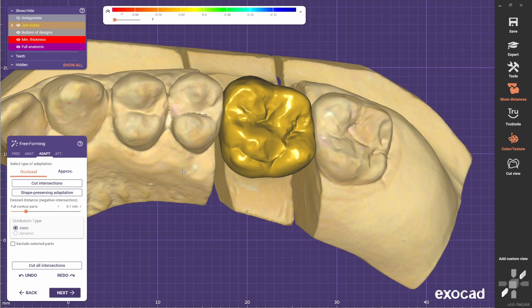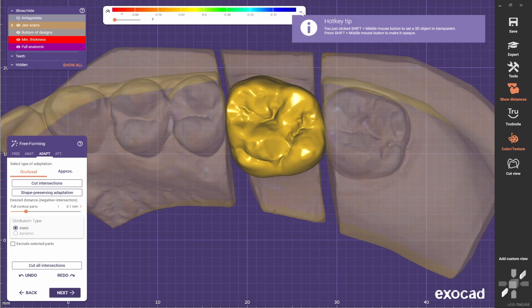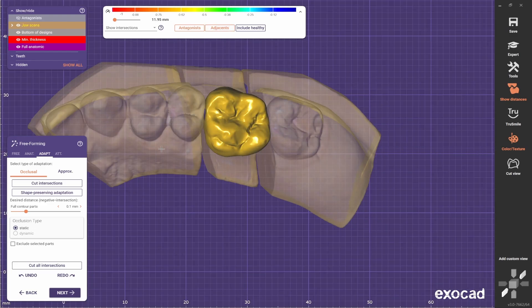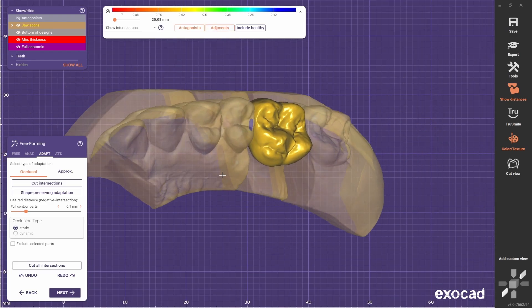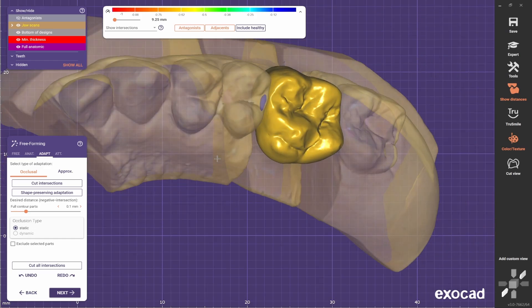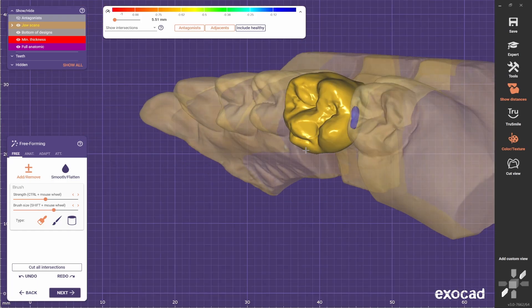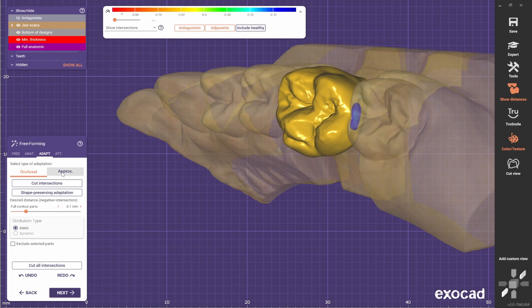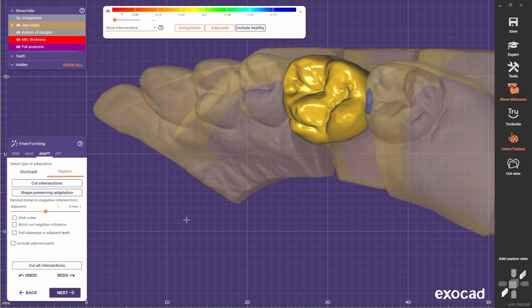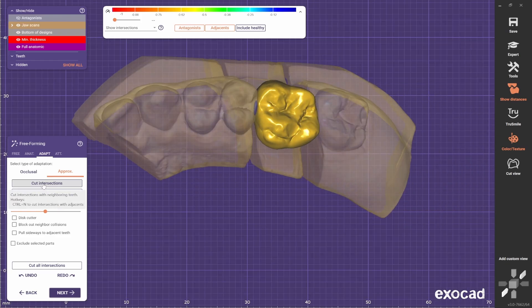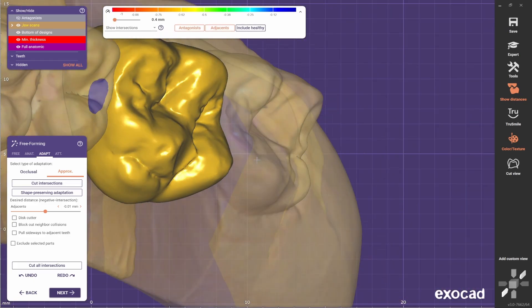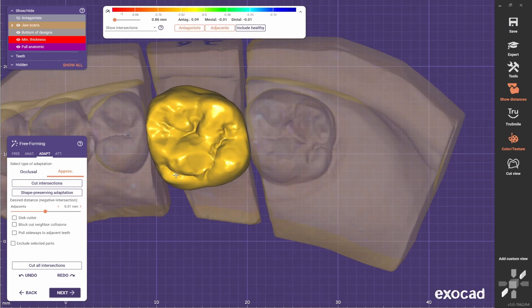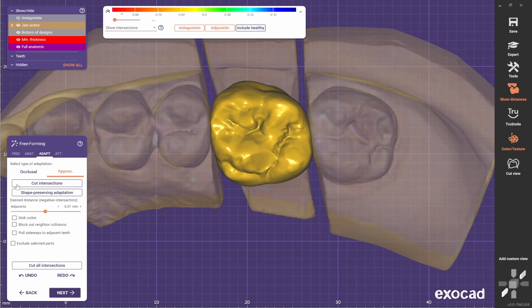I like to do the same on the proximal ones. If you come here, you can select adjacent, and you see that it's touching the adjacent teeth. Usually I like to make the contact point a bit stronger. Then use the adapt tool on the proximal and select this arrow to make it minus 0.01, and use the cut intersections tool to make sure that there will be a contact point after the milling.